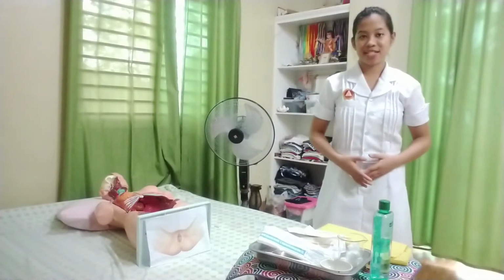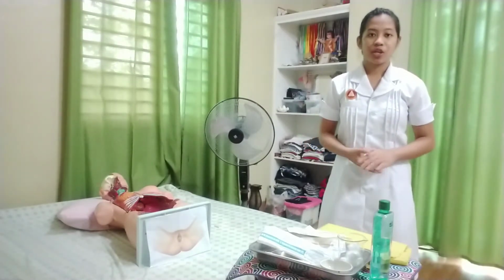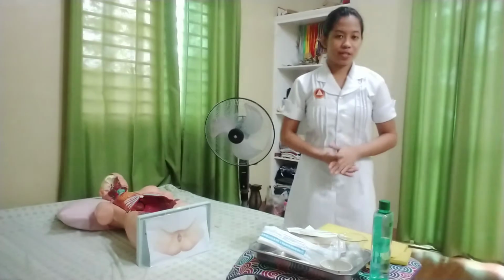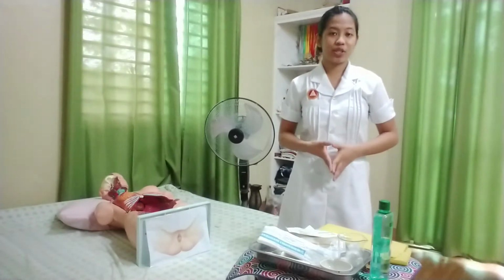Isabel from BSN2B, and for today I will be performing the female and male urinary catheterization into the urinary bladder using an indwelling Foley catheter.